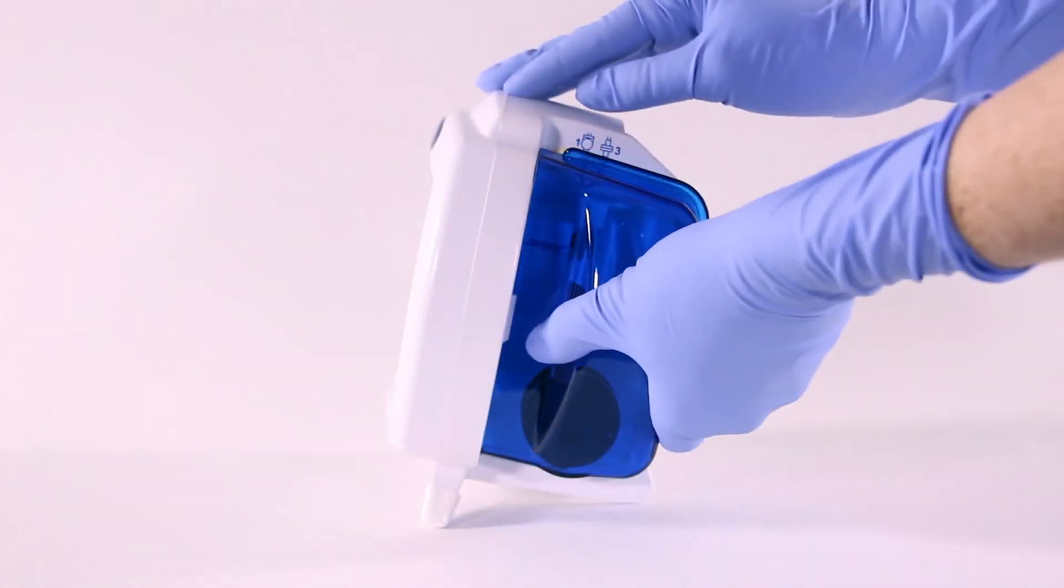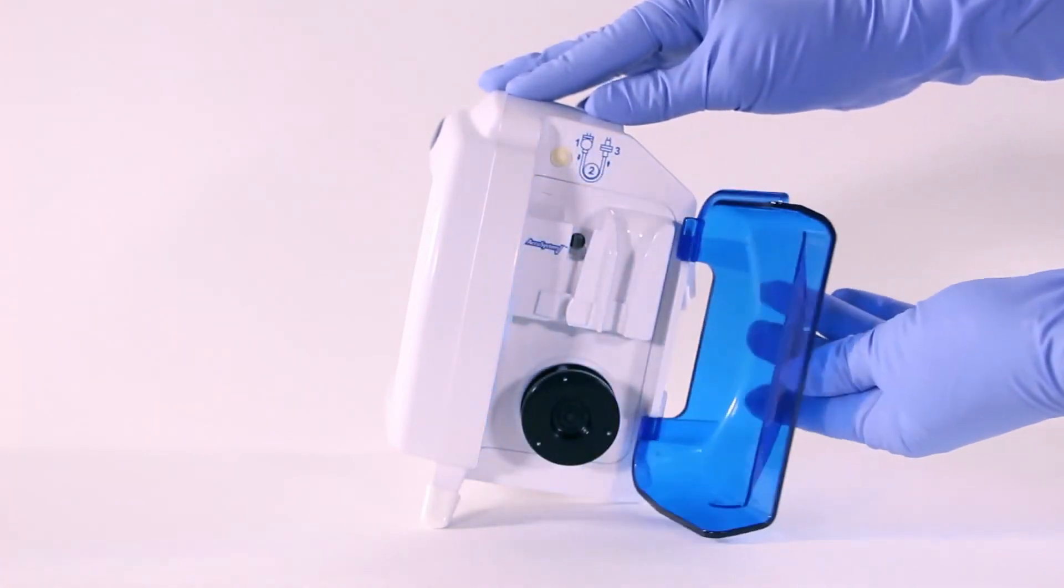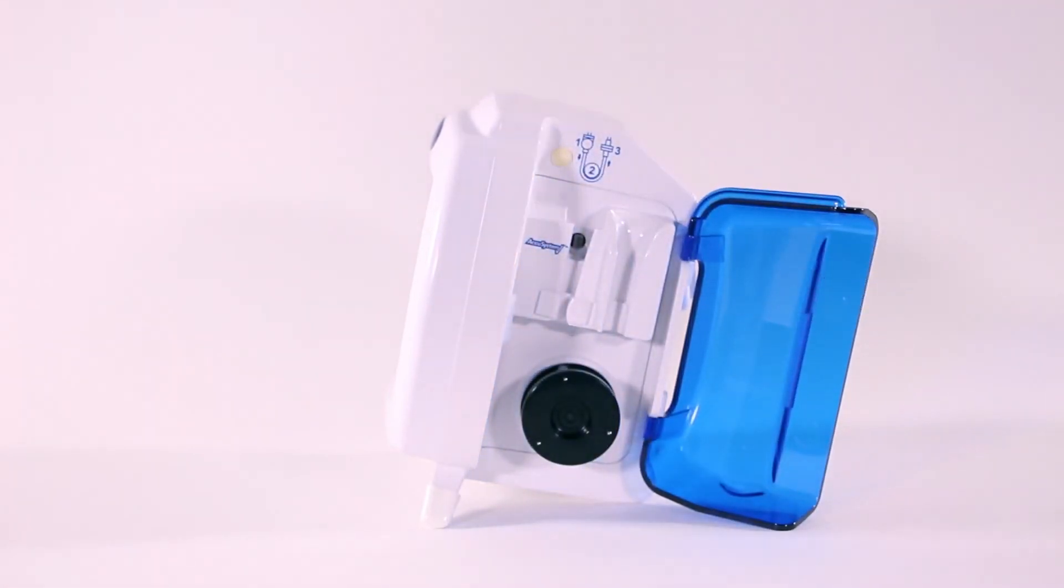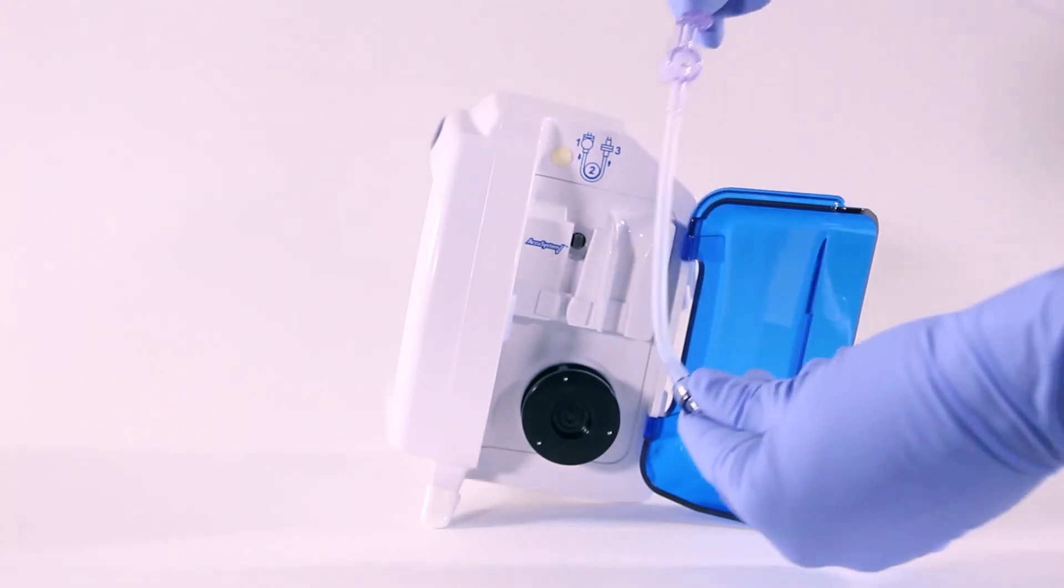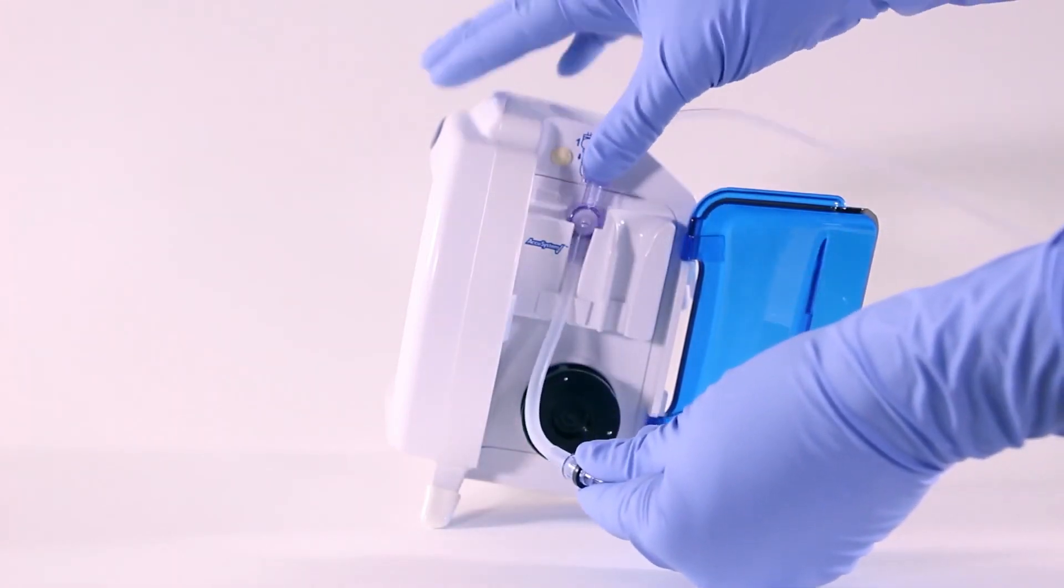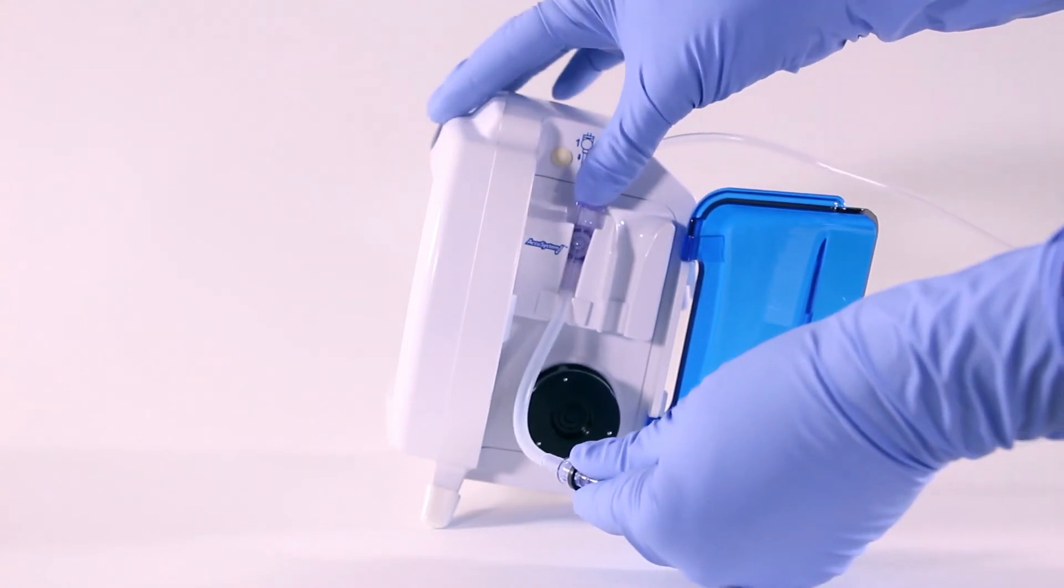Next, open the blue door to the feeding set loading area. Grasp the thumb tab on your feeding set and insert the tab directly into the left pocket of the loading set area. Press down firmly on the thumb tab and align with the white line to ensure it is seated.